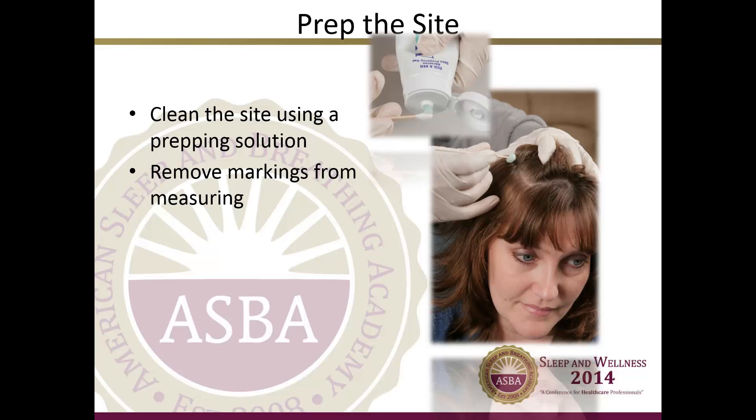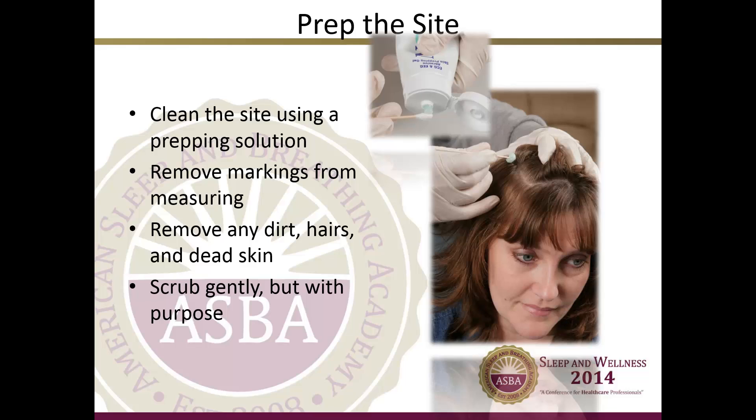These sites will have markings on them from when you measured the patient's head. The markings should be erased by the prepping solution, and any dirt, hairs, and dead skin should be removed. Be sure to scrub gently, but keep in mind you are purposely trying to remove anything that could impede the electrode's ability to connect with the scalp. Prepping solutions are electrically conductive so they do not need to be removed before applying gold cups. Other electrode sites on the patient's skin should be wiped clean with a gauze pad after prepping. Large wrinkles and loose clothing should be pulled tight before placing the respiratory belts. Sometimes it is helpful to shave the parts of a patient's chest where EKG electrodes will be placed, rather than ripping the hairs off with the electrode in the morning.